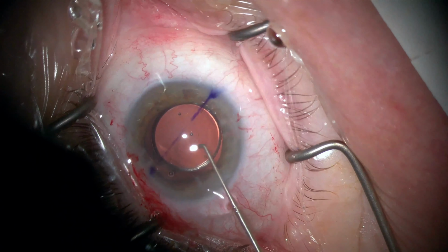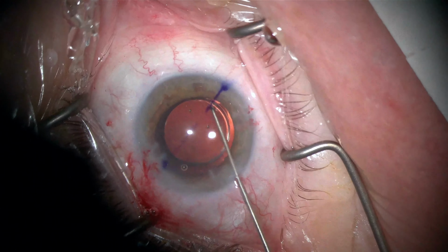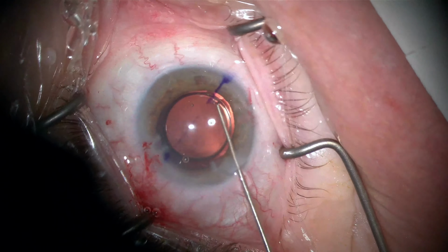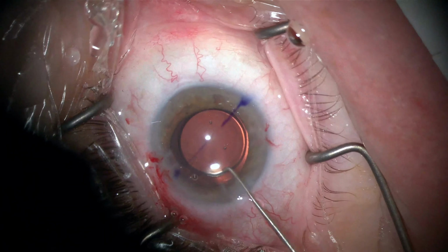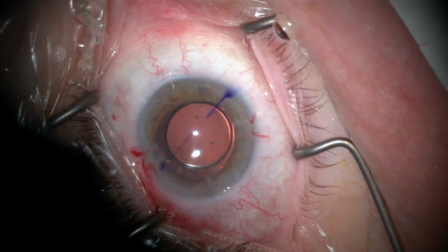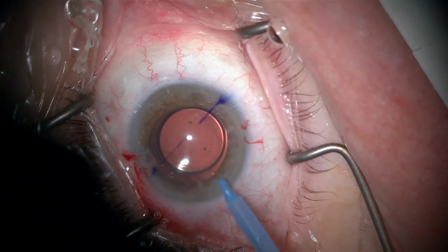And that seemed to work pretty well in this case. And then here I'm just dialing the IOL into perfect position. And once I'm satisfied with the position here, then the only step remaining is to remove the viscoelastic.